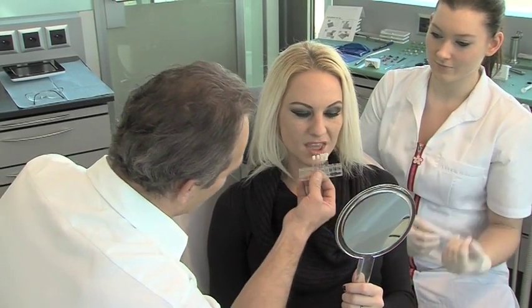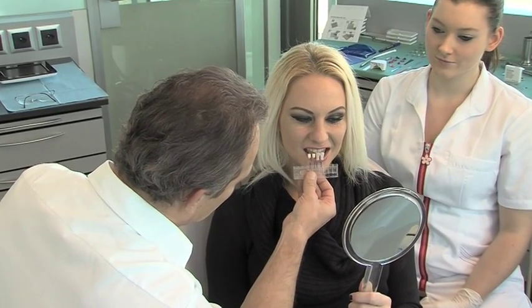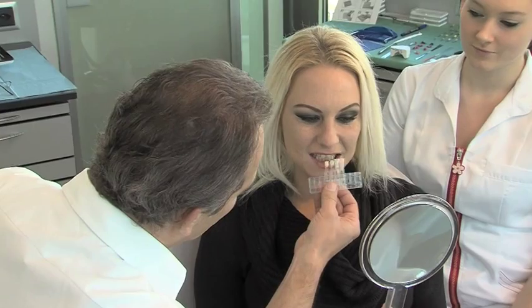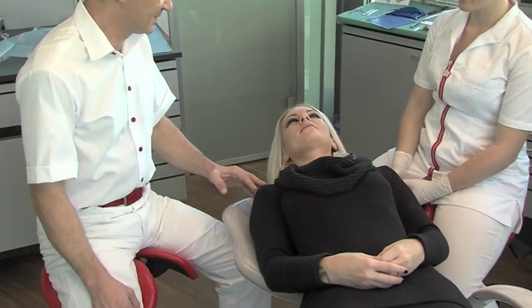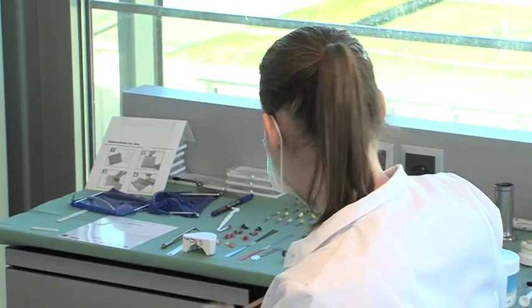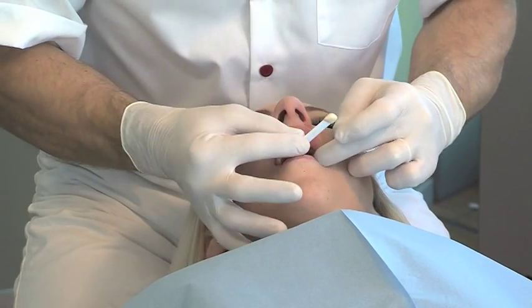Patient and dentist can jointly select the target shade using the Coltene Whaledent Shade Guide. A shade matching the brightness of the whites of the eyes will usually be found to be a close match. An acrylic stick aligned to the occlusion with dental putty simplifies the subsequent alignment of the occlusal plane to the facial symmetry.